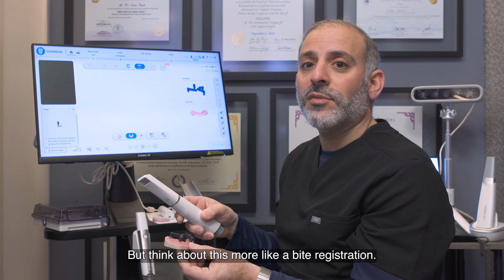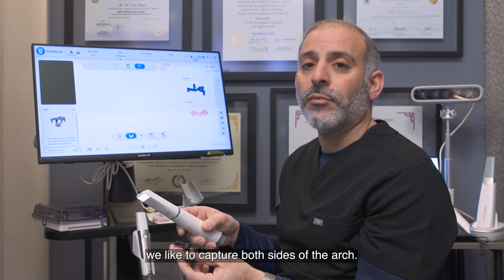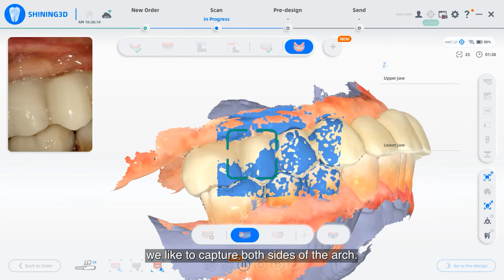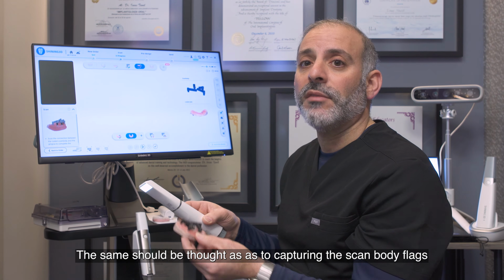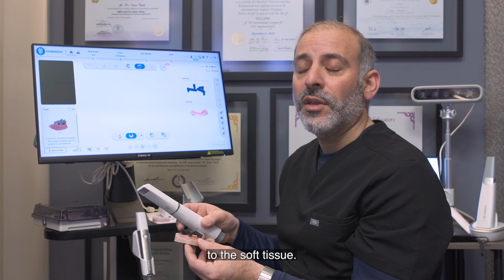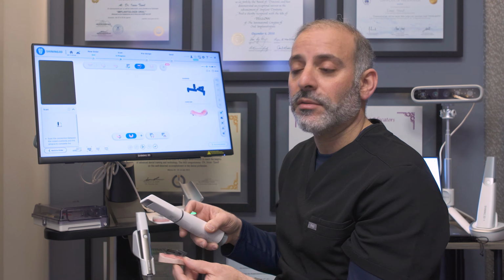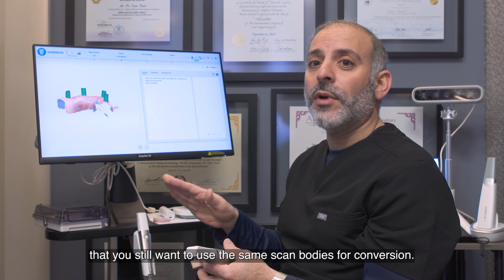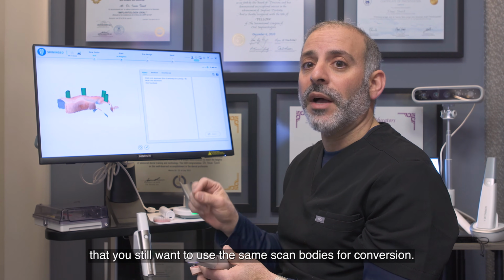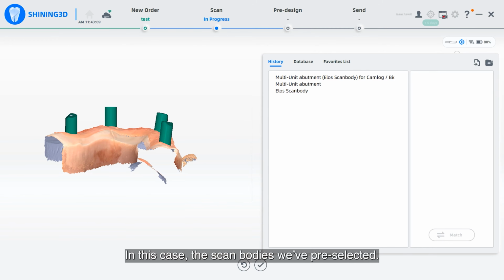But think about this more like a bite registration. When we take a bite registration in the mouth, we like to capture both sides of the arch. The same should be thought as to capturing the scan body flags to the soft tissue to be able to make sure that we have an even matching on both sides. The software then prompts to make sure that you still want to use the same scan bodies for conversion. In this case, the scan bodies were pre-selected.